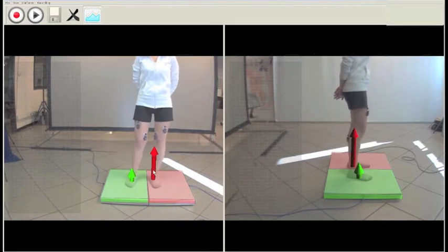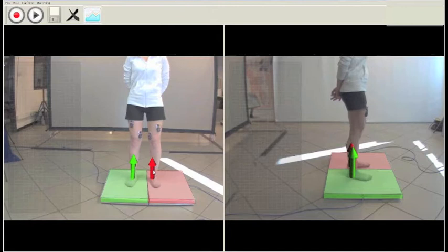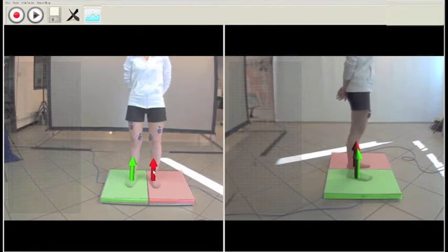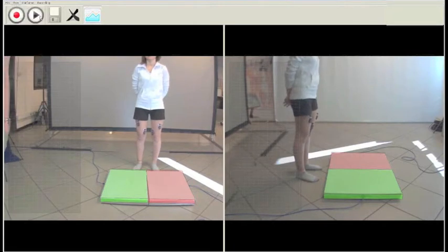As you can see, while she's changing the barycenter, you can see the two vectors going up and down depending on which direction she's bringing the center of the body. If she goes back to the platform and we decide to make an analysis, I can show you. Okay. We can start the real acquisition.